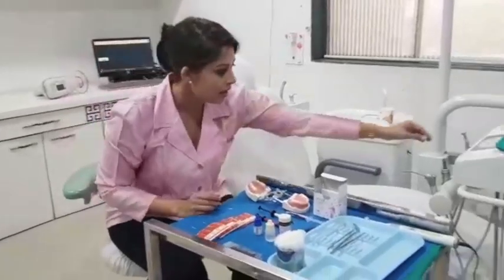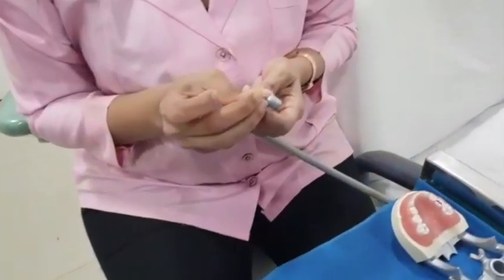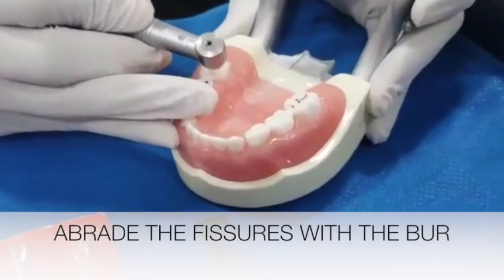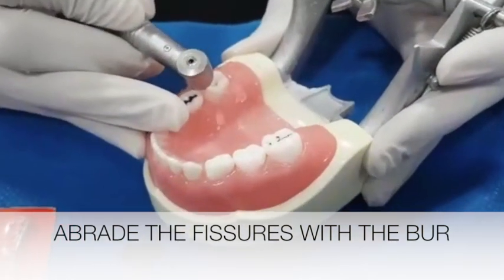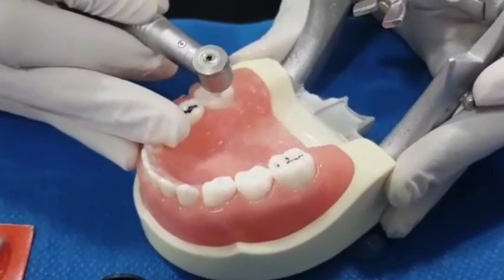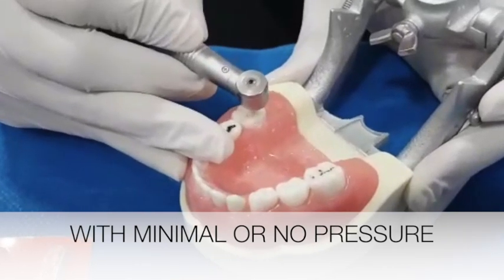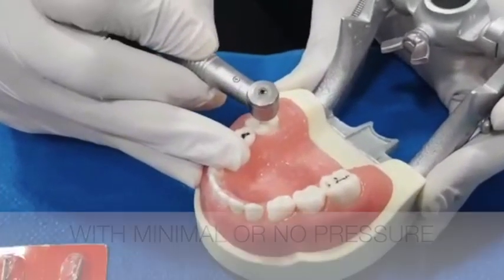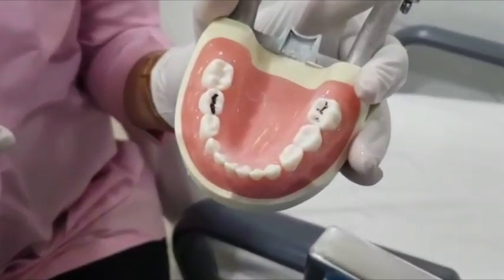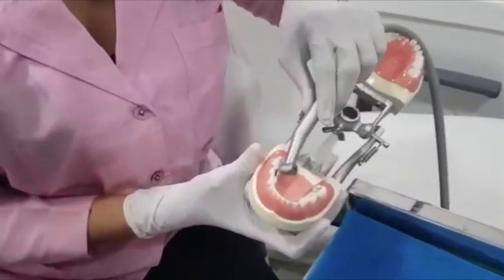Now let's go ahead with the procedure. I will take the handpiece and I am going to choose CD54F. This is the fissurotomy procedure — I am going to abrade these fissures with my fissurotomy burr, plainly following the groove. That's it. We have done our fissurotomy with the help of the fissurotomy burrs, using CD54F.